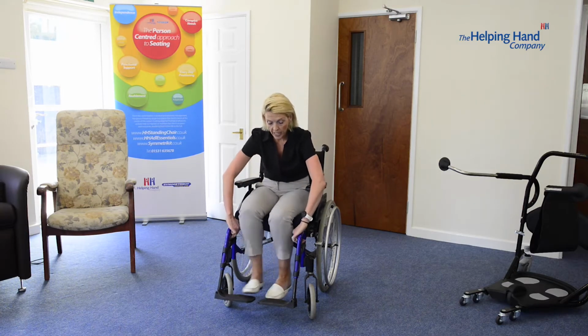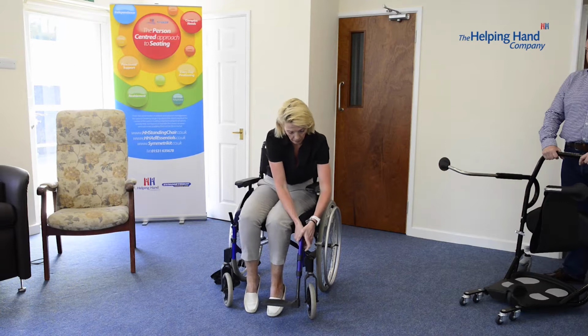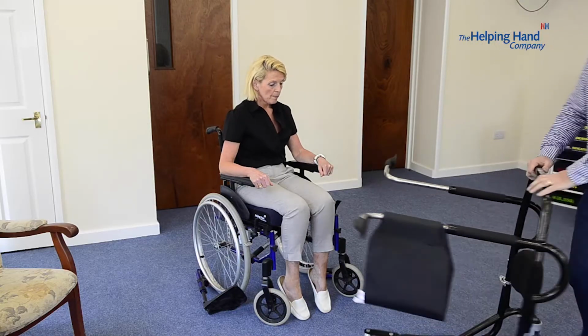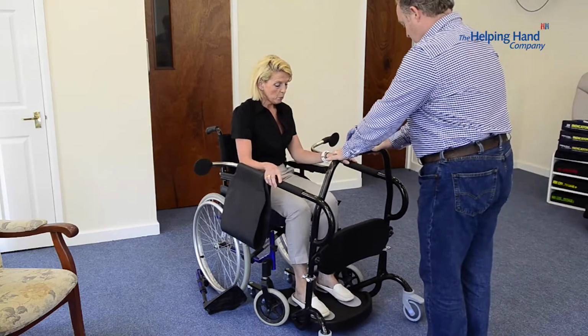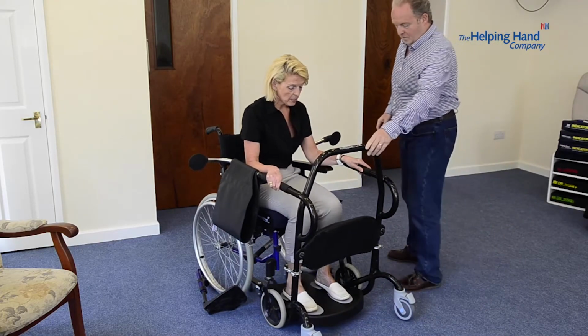So we're just going to show now doing the transfer from a wheelchair onto the cricket. Obviously I'm nicely seated here. I need to remove these foot plates out of the way. Okay, so bringing the cricket round now. Again, remembering that critical measurement between the wheels of the wheelchair, that 13 inches. Right in there, that's it, that's lovely.